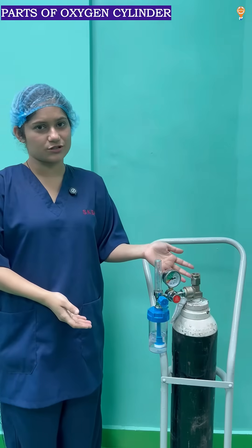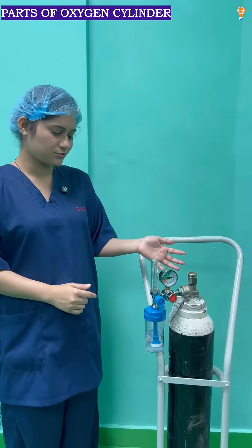Hi everyone, let us see the parts of oxygen cylinder and let us know new things for the viva questions.